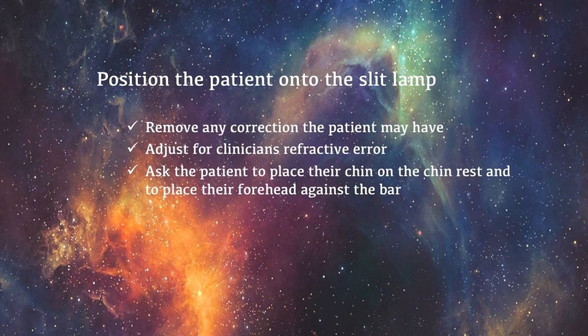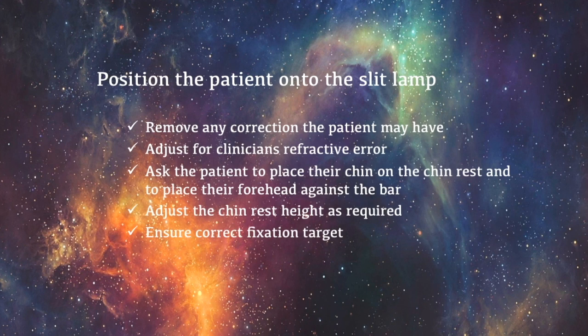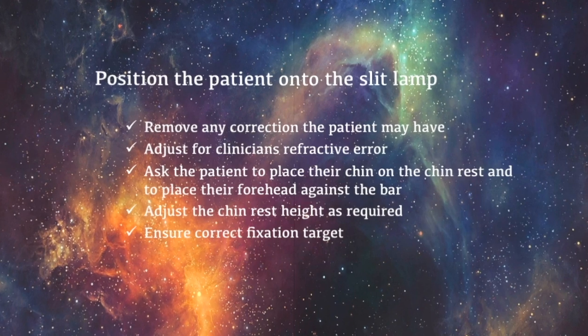The patient can hold onto the handles if it is more comfortable for them. To adjust the height of the chin rest, rotate the chin rest adjustment knob until the patient's outer canthus is in line with the indicator mark located on the slit lamp bar. Lastly, ensure the patient is fixated correctly by asking them to look at the clinician's ear or at a distance target.